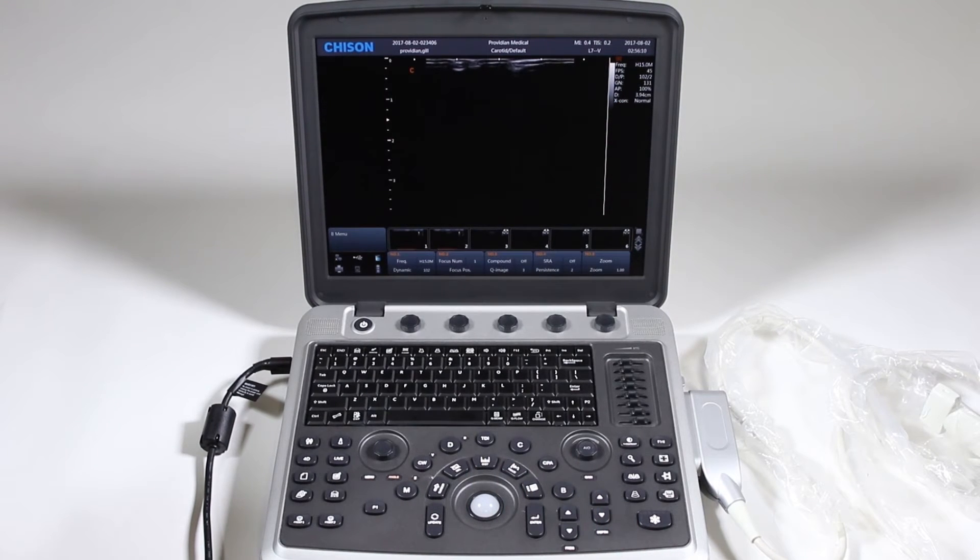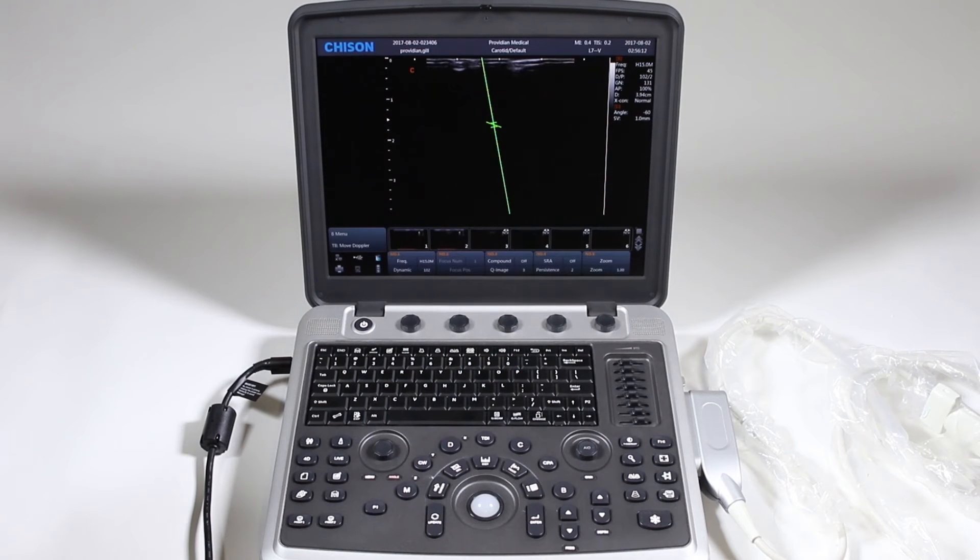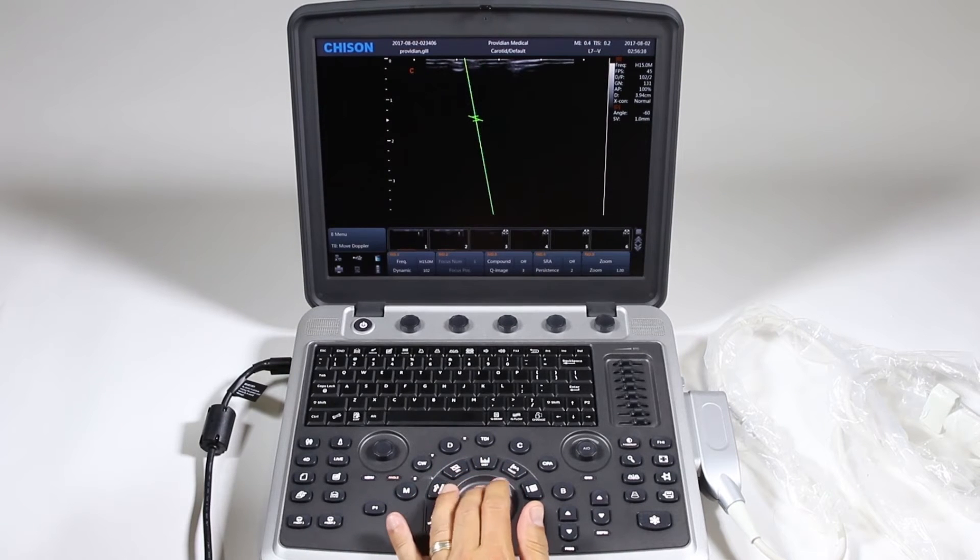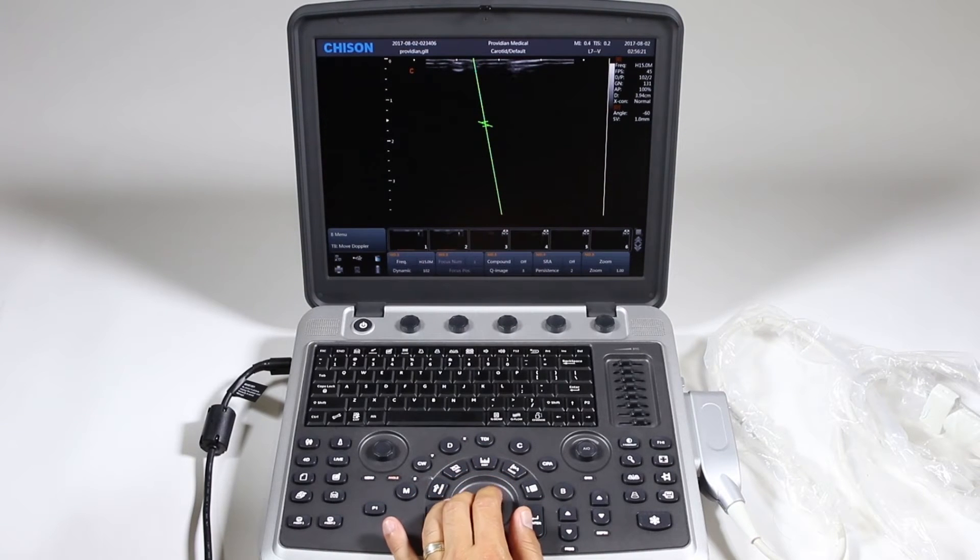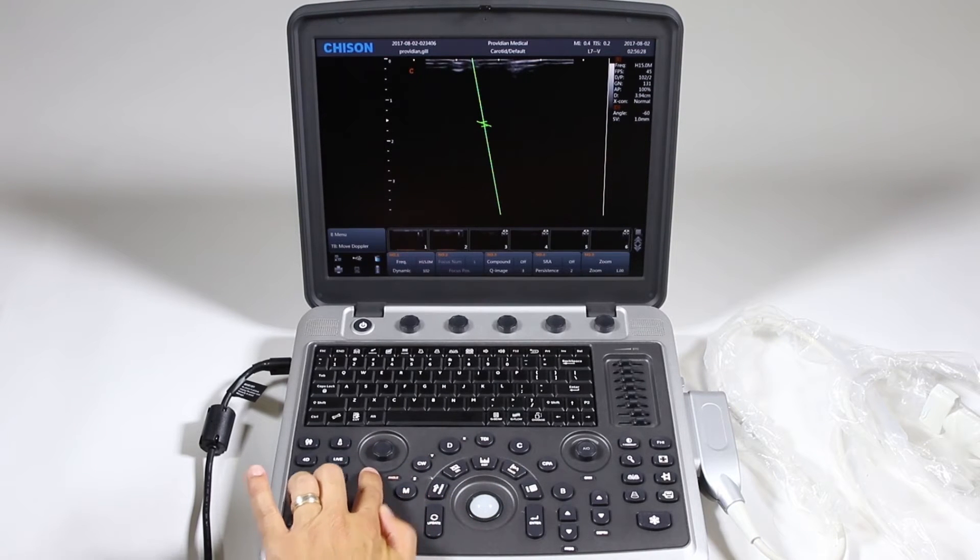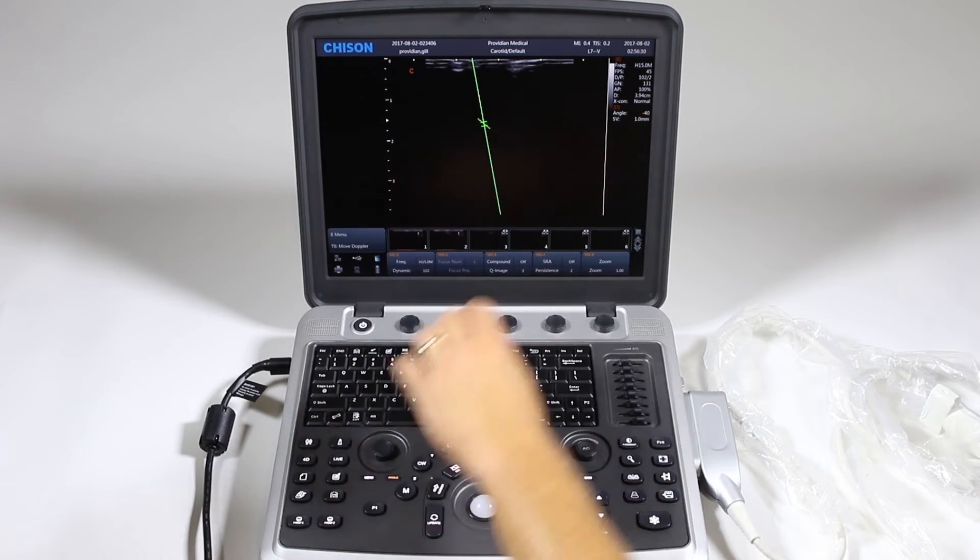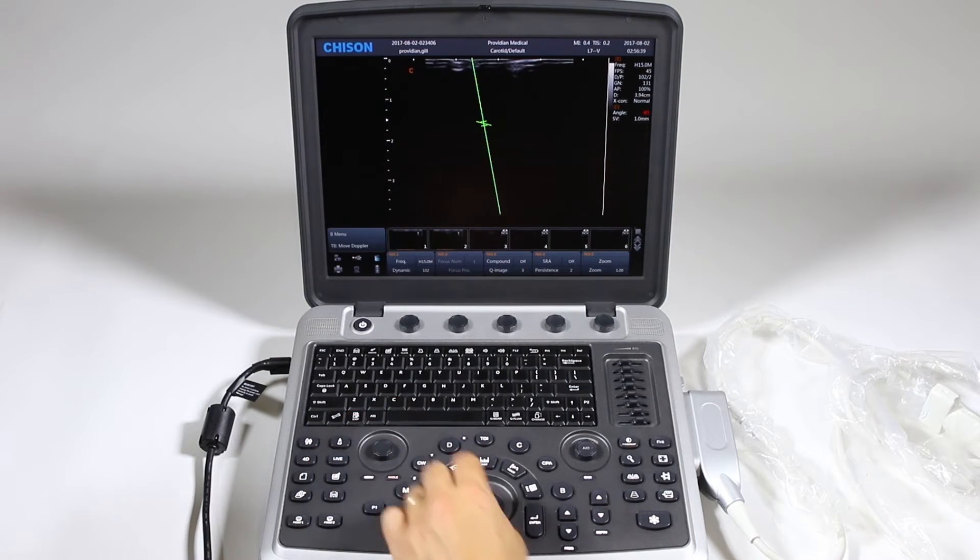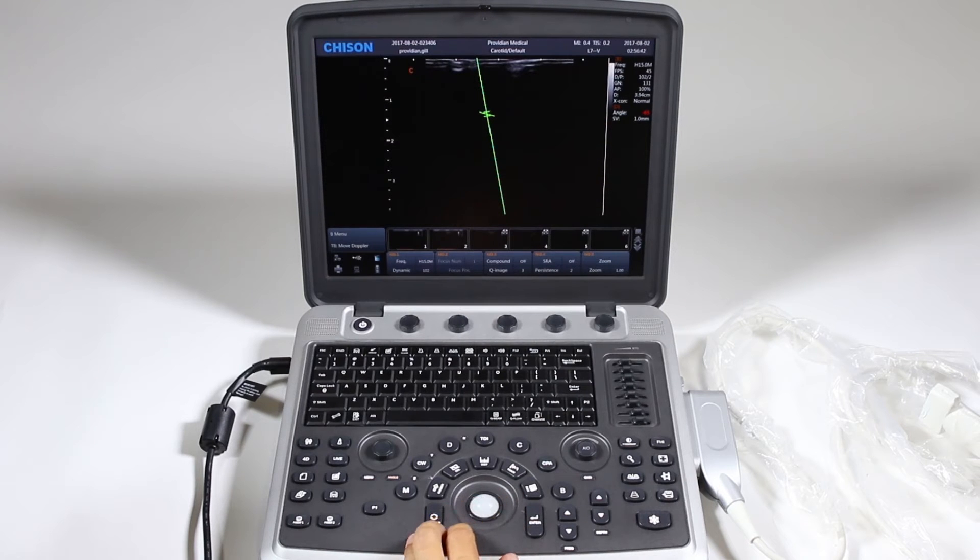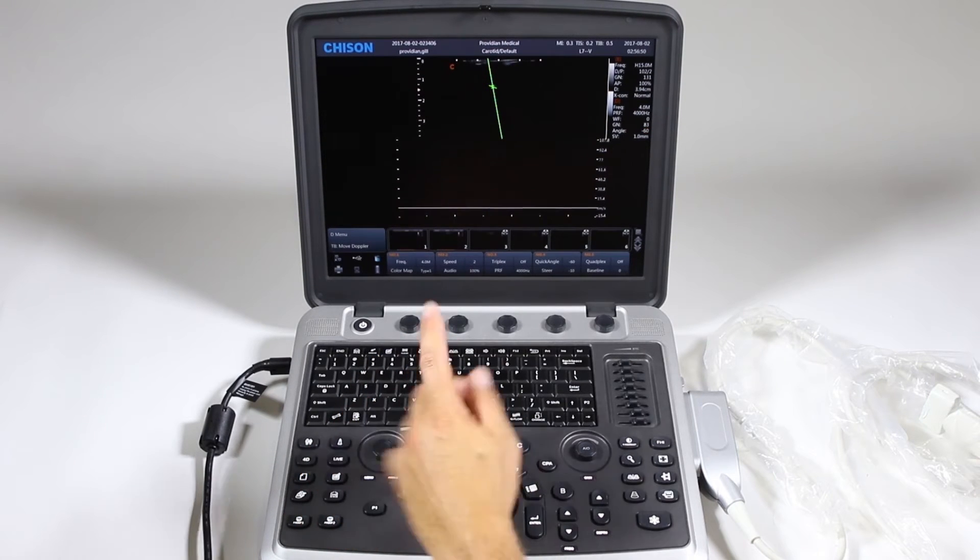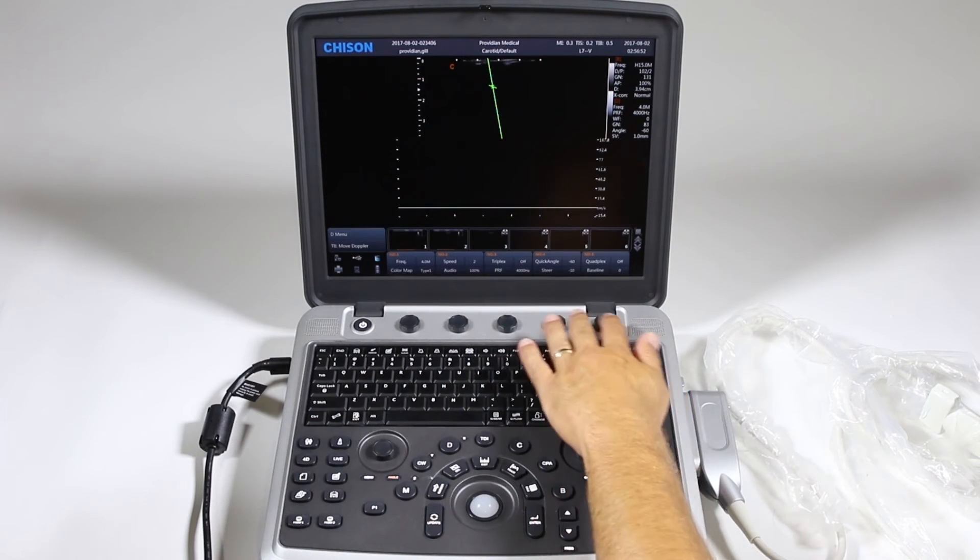Now going into Doppler modes, you'll just click D to go into Doppler and you'll get your reference line here. Move the trackball and you can do various things. Now notice over here we have angle as highlighted so you can now twist and change your angle and the reference angle will be shown here. Just go to 60 and if you want to steer you'll see that in the next part.